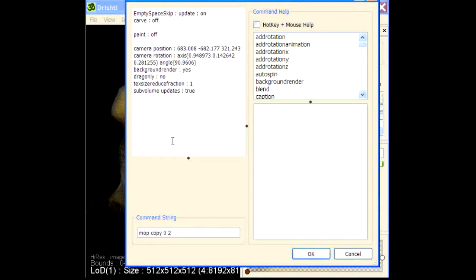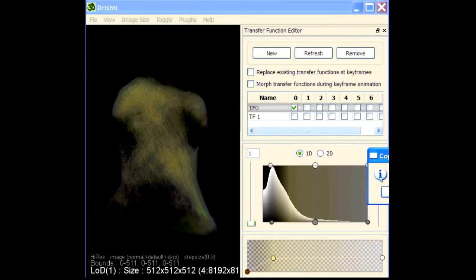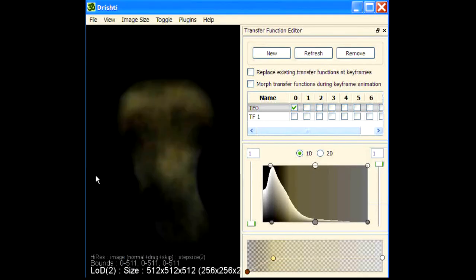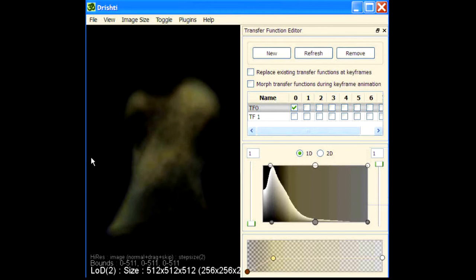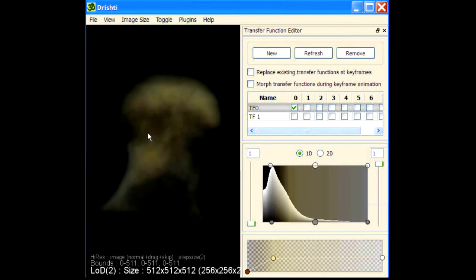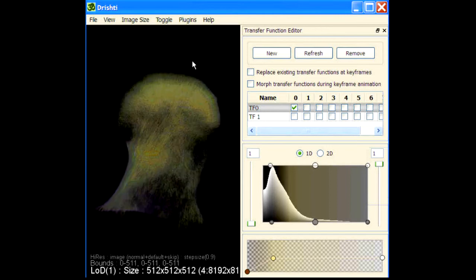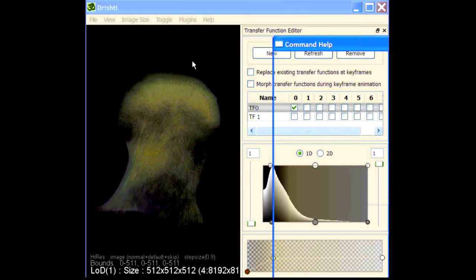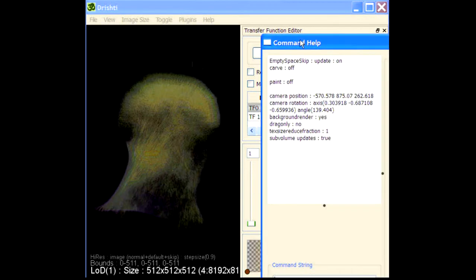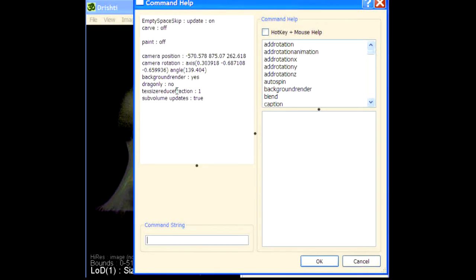What I'm doing now is copying channel 0 to channel 2. It's done. And then what I will do is saturate channel 0. Saturate by default is always going to saturate channel or work on channel 0.